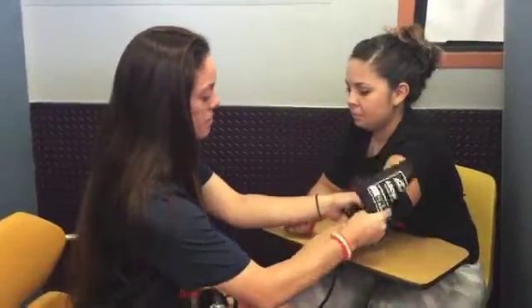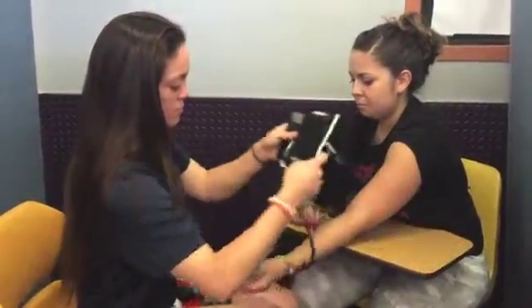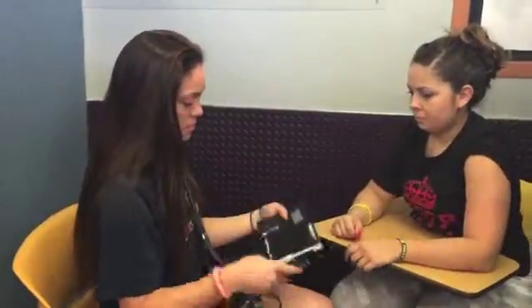With your two numbers recorded, the last step is just to remove the cuff and explain to your patient what you've heard.